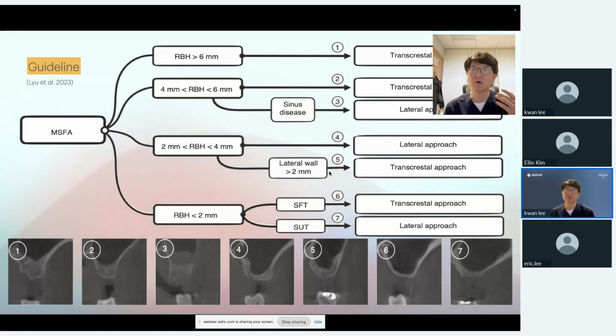No, I also touch base on the regular traditional crestal sinus approach. So we're going to cover in depth how I decide which one is a lateral sinus case and which one is a traditional crestal sinus case. If it is a lateral sinus case, then how can I convert the case to the crestal approach as well.